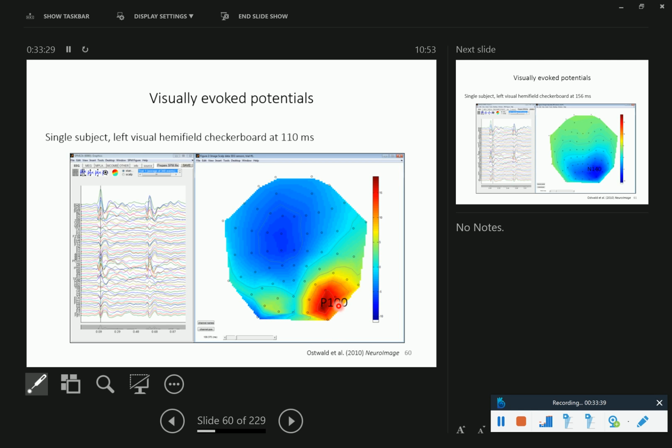Yes, it's something positive, but on a lot of electrodes, the P100 actually looks negative, because the P100 is linked with the idea that we look at electrodes over the visual cortex, which are of course the electrodes here in the back, something like PO8, O2 for the right side, and correspondingly PO7 and O1 for the left side.